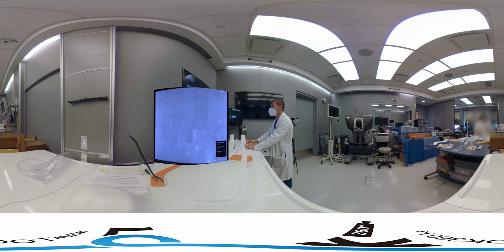We're going to fluoro. I'm going to come up with the wire, follow with the catheter. Again, I'm going to come up to the level. For this, we want to get the hepatic arterial supply, right? So we're going to come up to the level of the celiac axis, somewhere around T12. We're going to do a little injection here. And you can see there that we selected the SMA. So the celiac should be just above that. So we're going to come back a little bit. We're going to get above that.